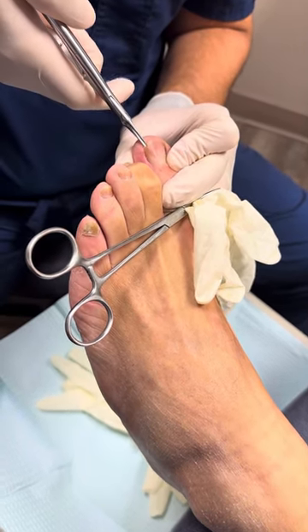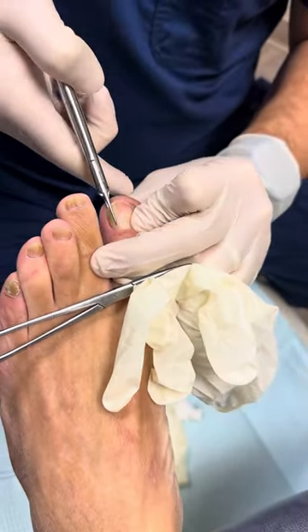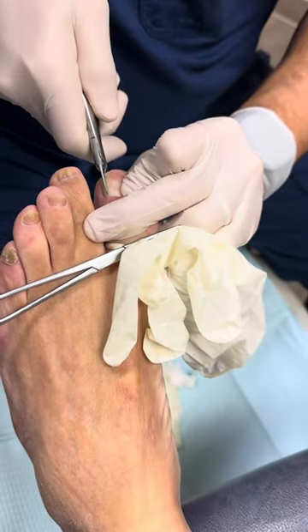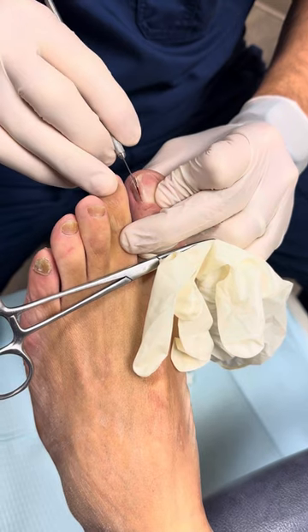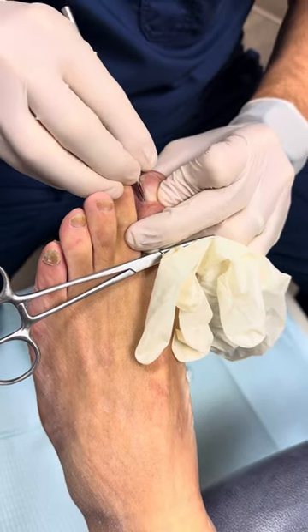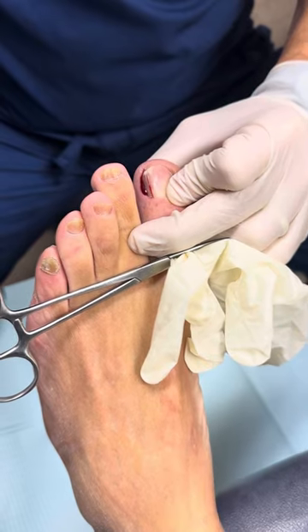We take this instrument called an English Anvil Nail Nipper — you're going to feel a little pressure, okay? Any pain? No? Good. We're going to push that all the way back to the base of the nail and split the nail. Then we're going to take a number 62 Beaver blade and push it underneath, because the nail actually goes underneath the skin.